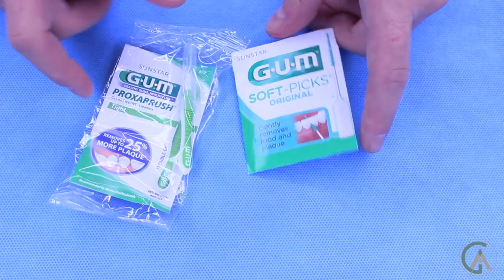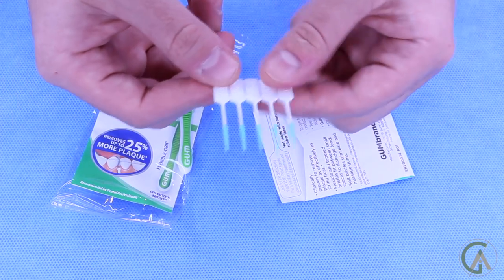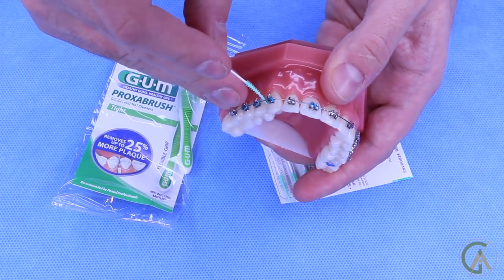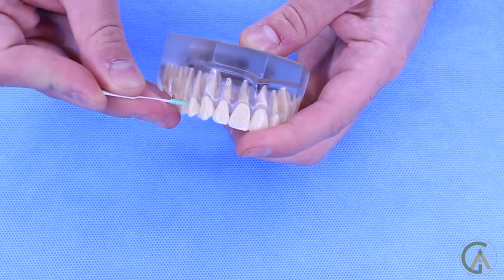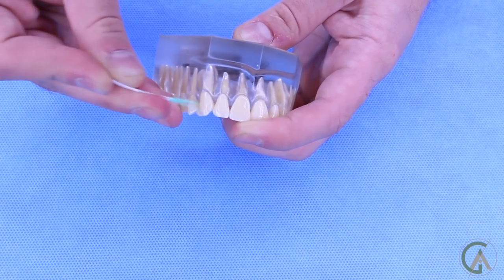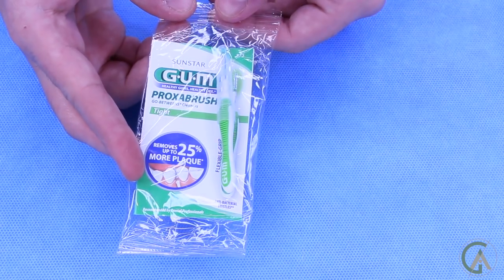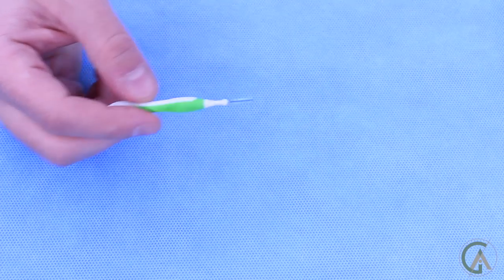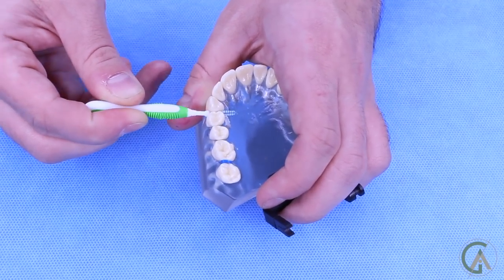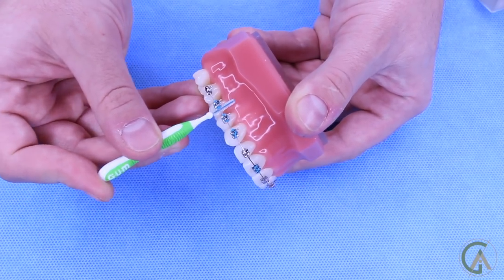Next, I want to show you Proxy Brushes and Soft Picks. I recommend the Soft Picks a little bit more because they're gentler on your gums. They come in packs of five — you break one off and push it through the contact to go in between the teeth, working your way around the mouth. If you have larger gaps or are an older patient with black triangles, you can use the Proxy Brush, which has bristles and is great to get in between teeth with those black triangles. They're also really good for cleaning around the brackets.